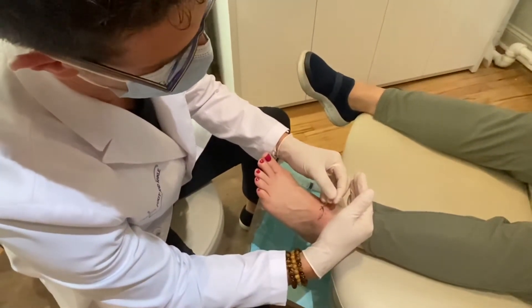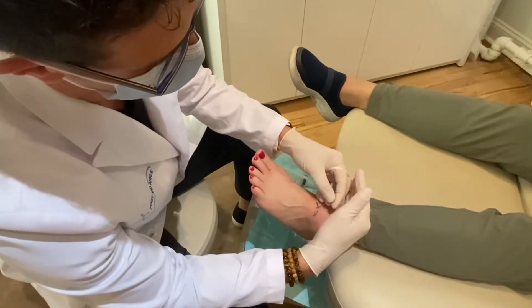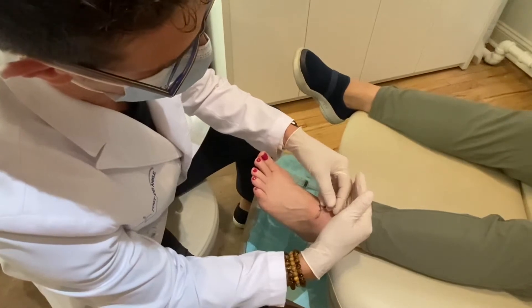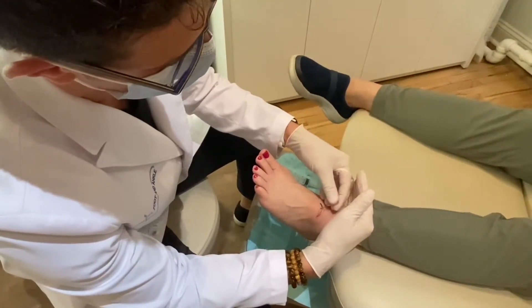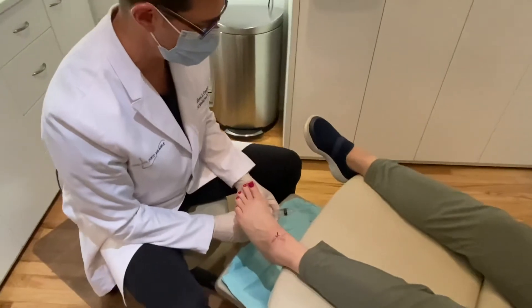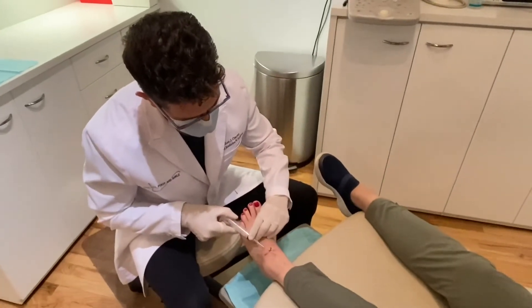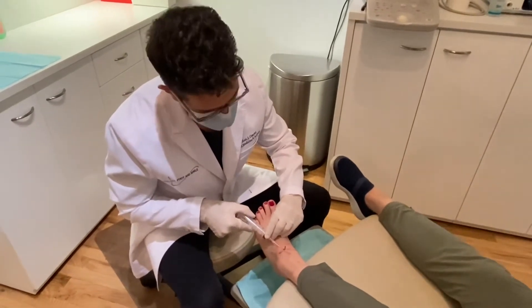Do you feel me touching you here? No. How about there? No. How about there? No. I definitely encourage you not to look down at this point — look at the pretty picture on the wall. Do you feel that? I feel your hand, but I don't feel it. Perfect.